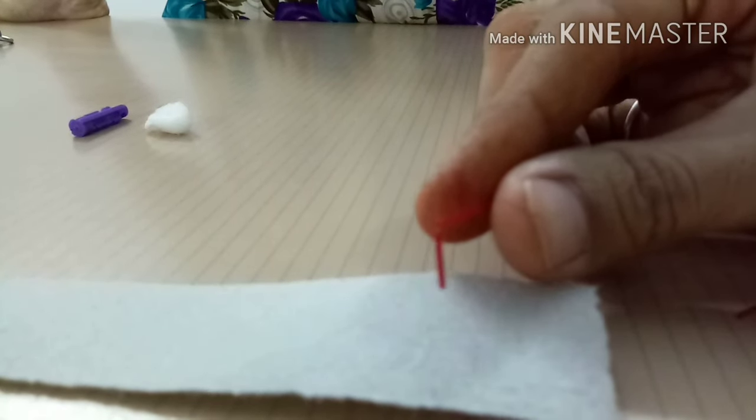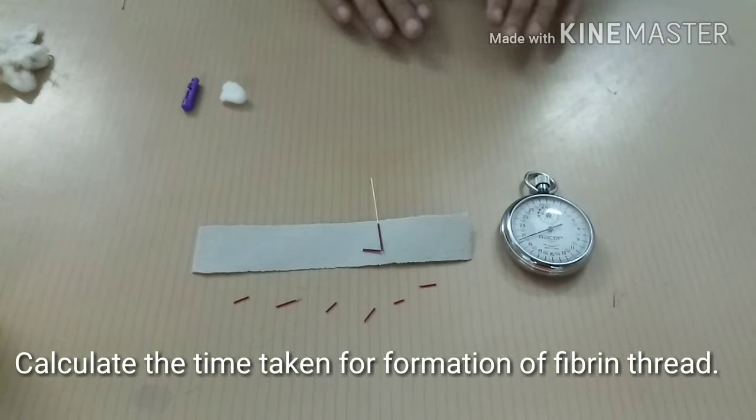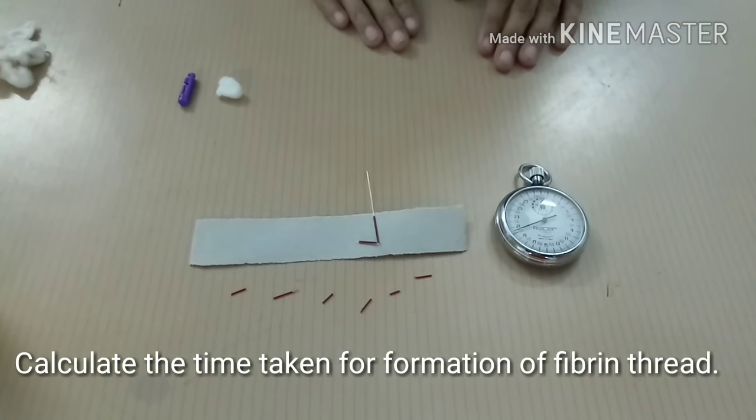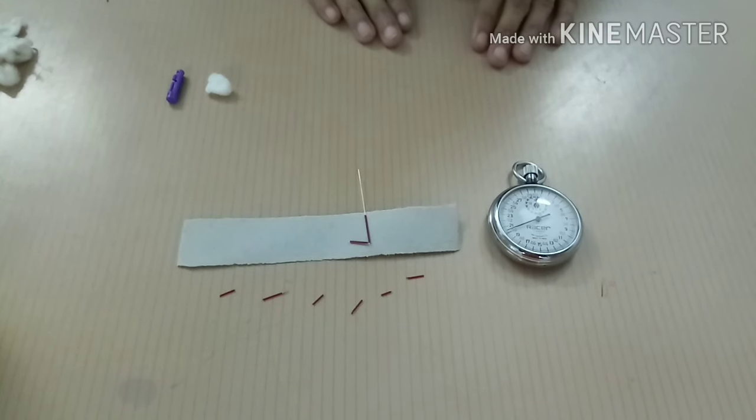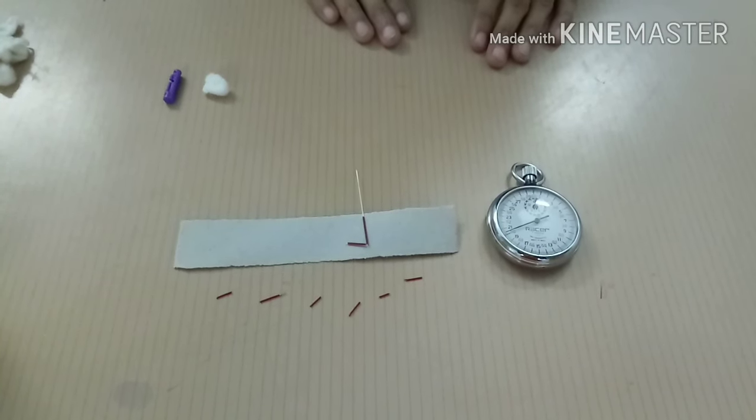This is the fibrin thread. Calculate the time and that is our clotting time. Note that clotting time is always longer than bleeding time.